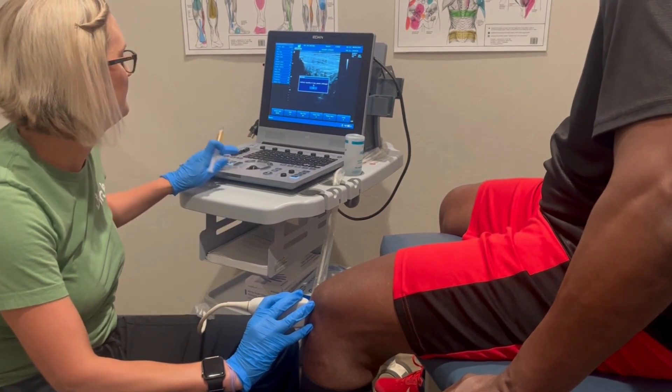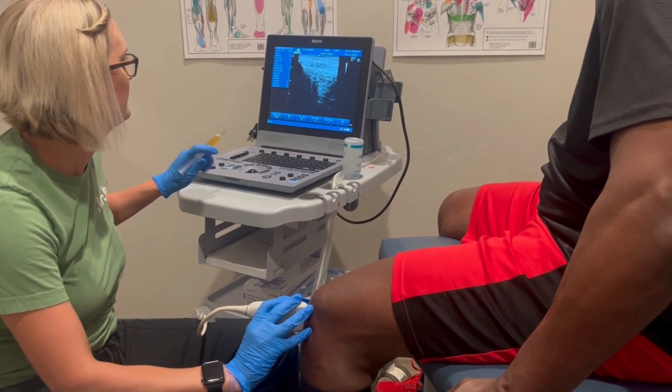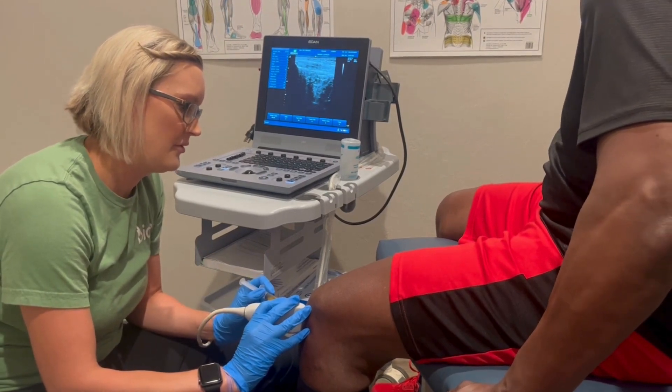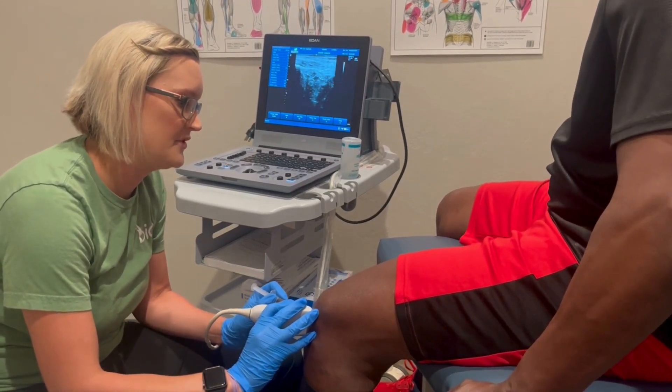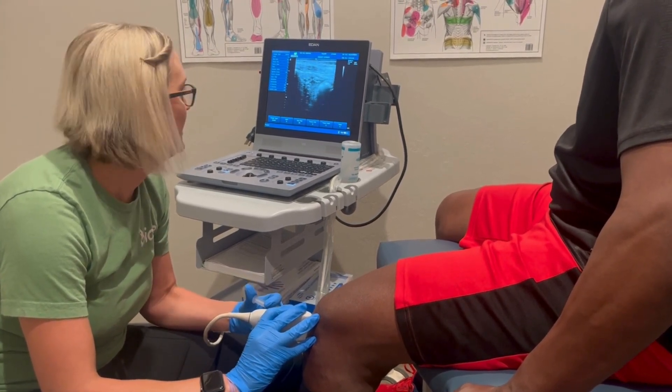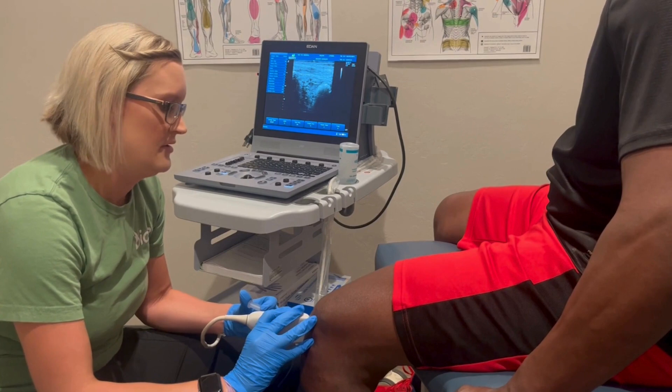We can show you a video of a guy that did it — it's not that bad, yeah, he did it. Good, deep breath — one, two, three, poke. You got this, you got this, pushing in. Do you see it on the screen? Can you see it there?